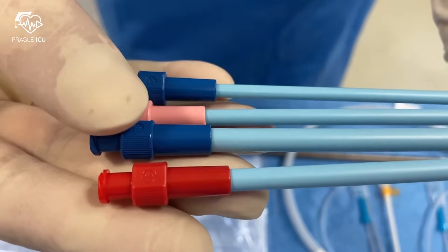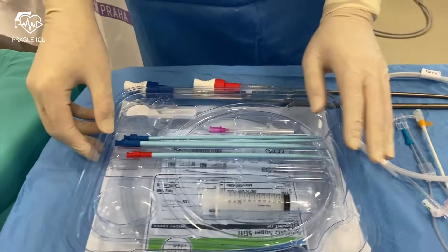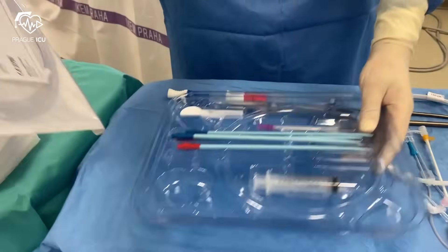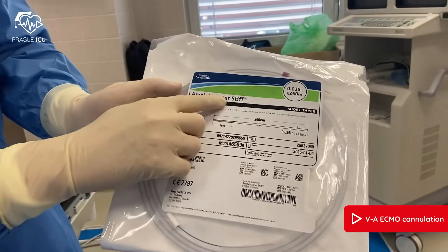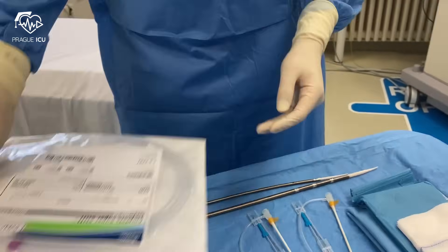The dilator sizes are 12, 14, 16, and 18 French. For larger venous cannulas we can use a special kit with even larger dilators. What is not part of the cannulation set is the Amplatz superstiff introducer wire, which we like to use as it gives us stability during insertion of large bore cannulas.